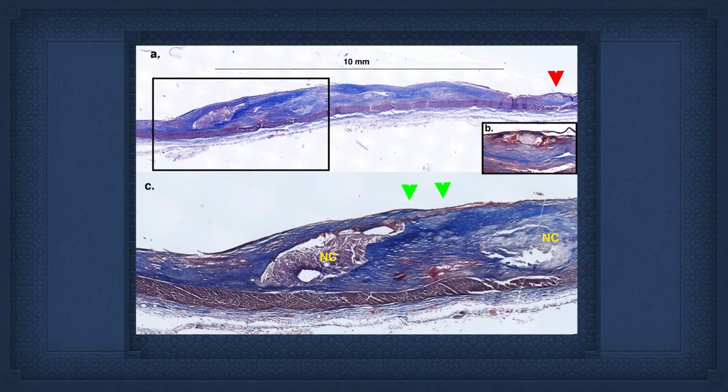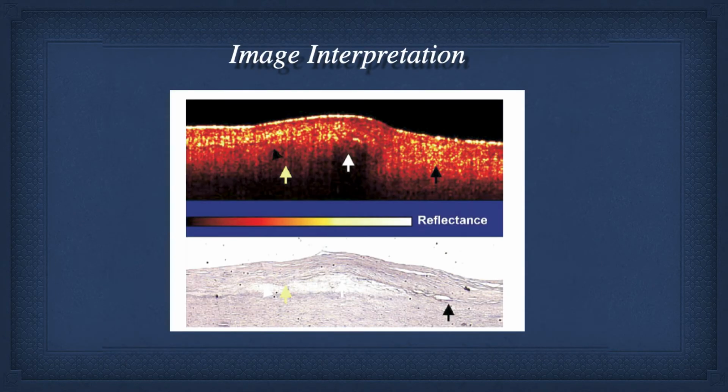But the point here with the slide is this: if I had my way, I would put the stent right over the top of this thing and prevent it from causing problems down the line. But you need to know what's in there. Now, the image interpretation, to a large degree for the last 20 years, people have used the diffuse border criteria, which right from the beginning we thought was not working. I mean, it was a nice postulate.